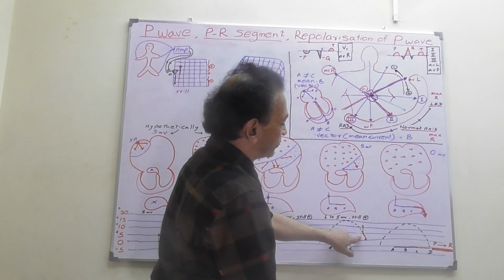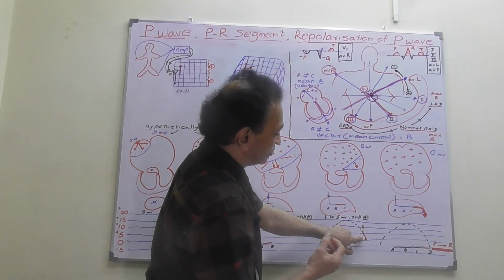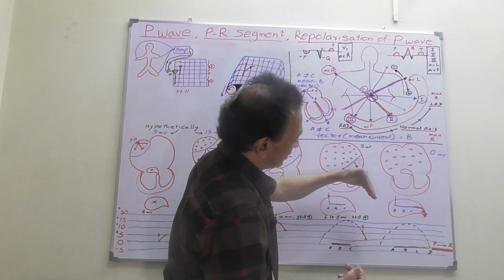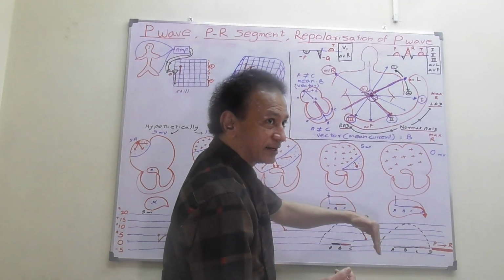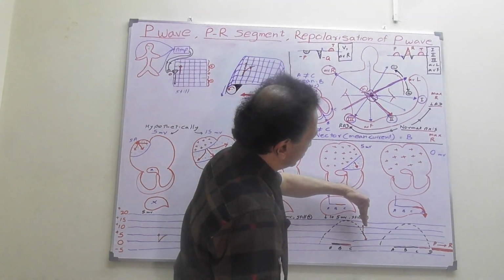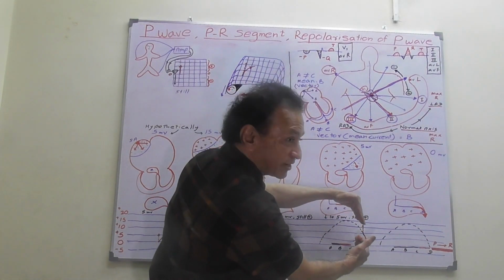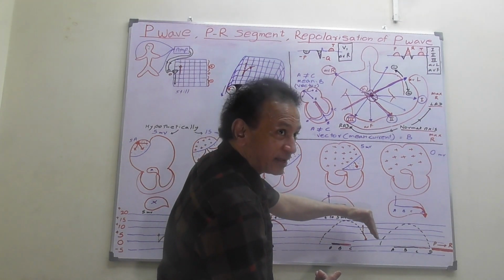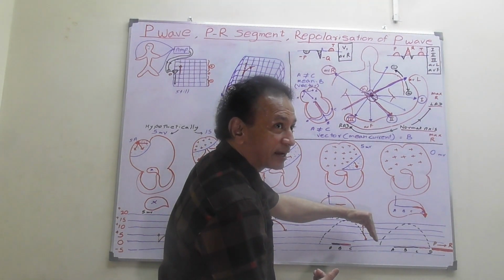As the total amount of current being produced is lesser, it should tend downwards rather than going upwards. So the ECG should go down like this, but as the ECG tracing is moving, it tends to produce a curved wave.